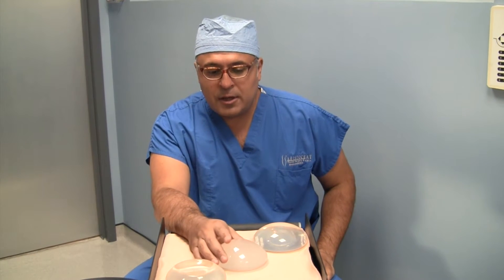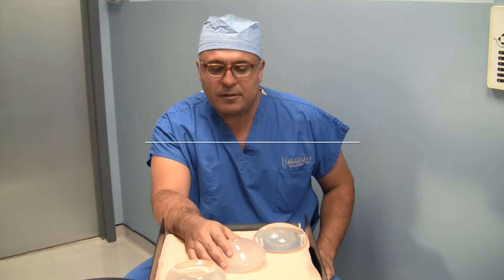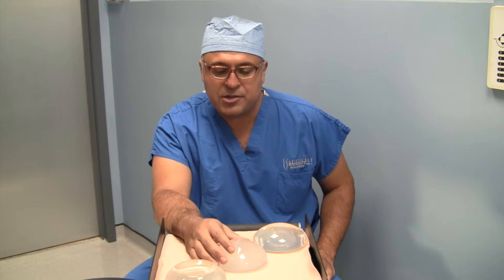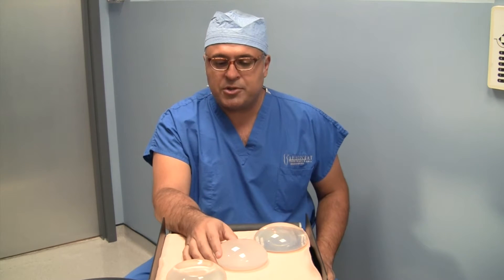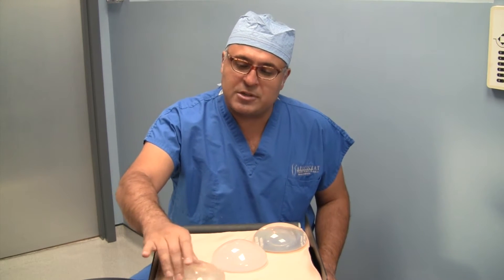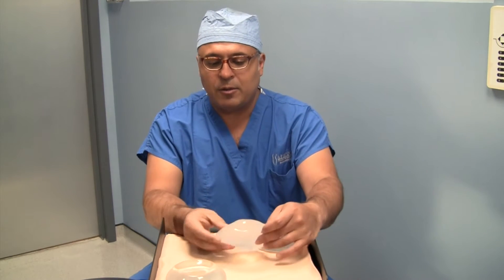Today we did a procedure called the Ideal Implant. This implant is newer and was FDA approved last year. It's a nice alternative to silicone implants. The patient today did not want to have her procedure videoed, but I want to show and share the difference between the traditional saline implants, silicone implants, and the Ideal Implant.